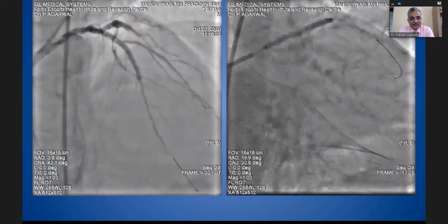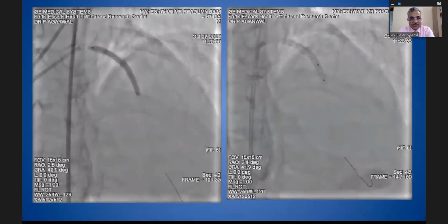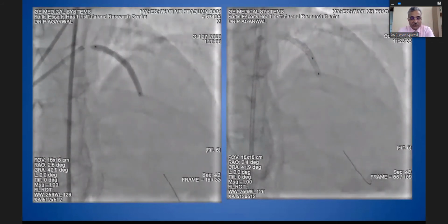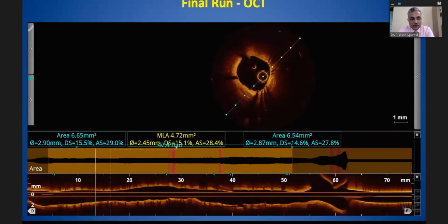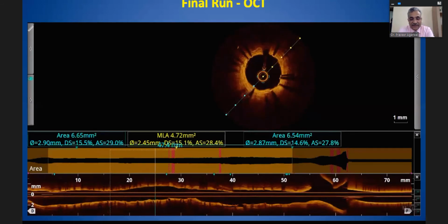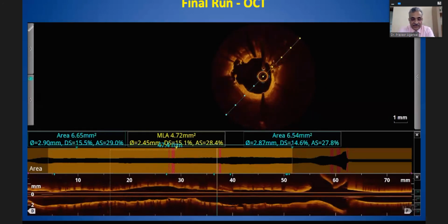Then take a 2.75 stent as per vessel size, deploy it at nominal pressure, then go with a high pressure balloon of the same diameter, 2.75, and see the OCT run. The stent looks well apposed, well open. The proximal and distal edges are fine, but in the middle the area looks a bit smaller than at the edges. The stent looks well expanded and you don't see any areas of malapposition, but still you want to improve on that. Just see this area in the center, it looks slightly less expanded.